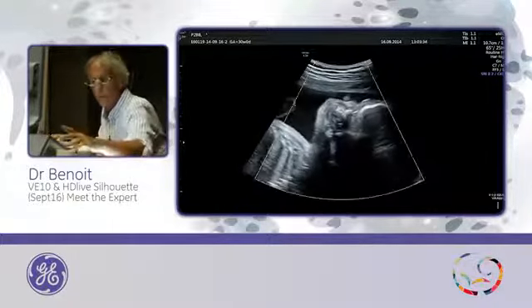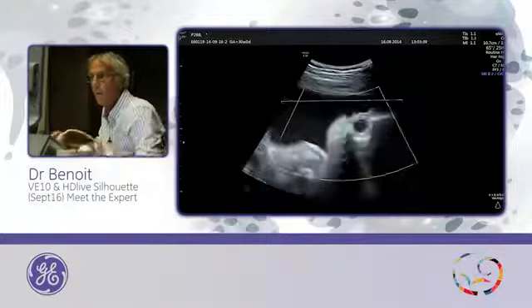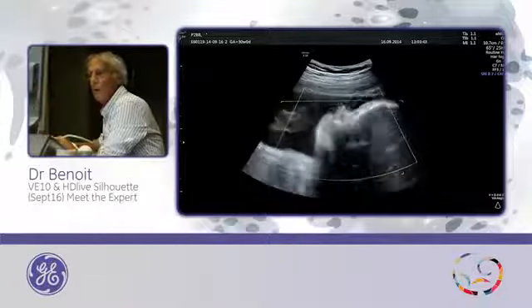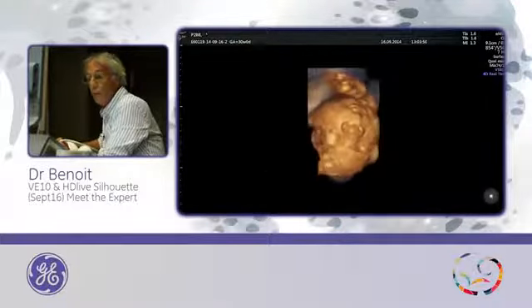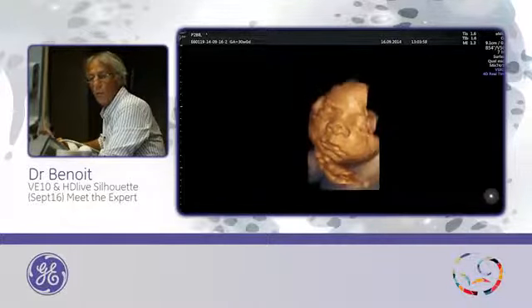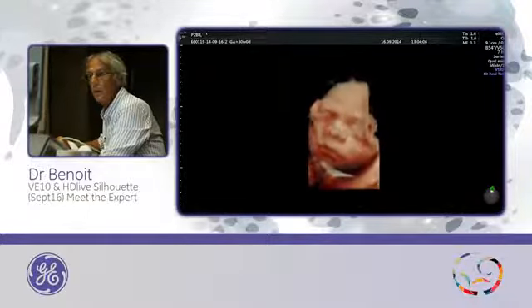So I will do it 4D, face. I need my foot switch. Yes. Okay. Good. I need to invert, and I need to go to sub-render. No, to go back to main render, to HDlive, and you will take the first one, this one.